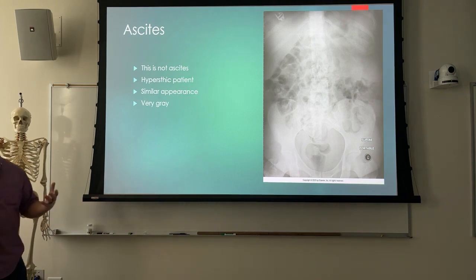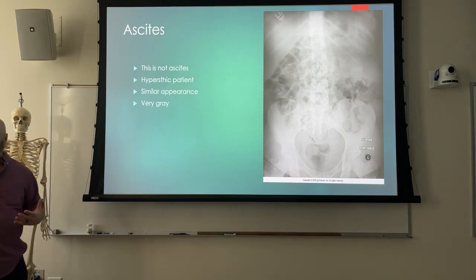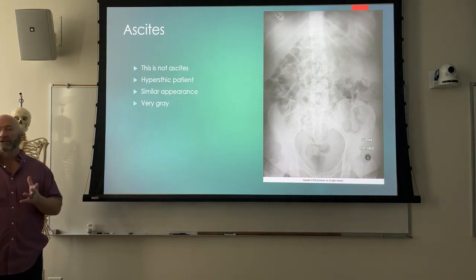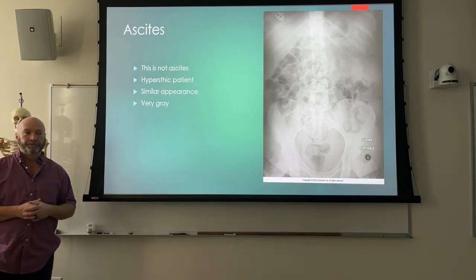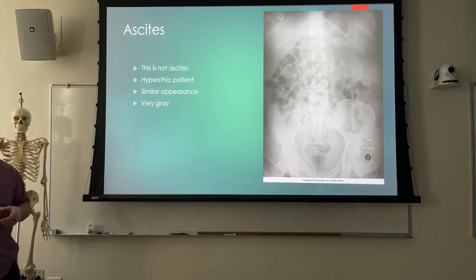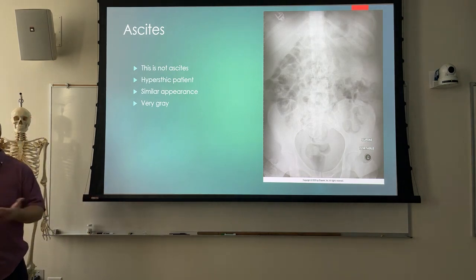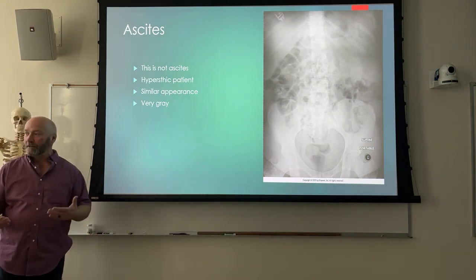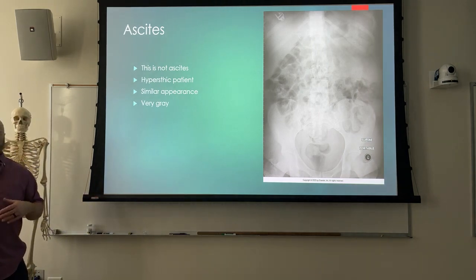So you walk into the patient's room, they've got this big distended stomach, they've got an NG tube in, and it's hooked up to a suction canister, and the suction canister has bile inside. That is a good indication the patient has bowel obstruction, okay? First off, maybe ask the nurse, look at the chart, read your request, see what you're shooting it for. But if all of that fails, that's your telltale indicator the patient's got bowel obstruction.